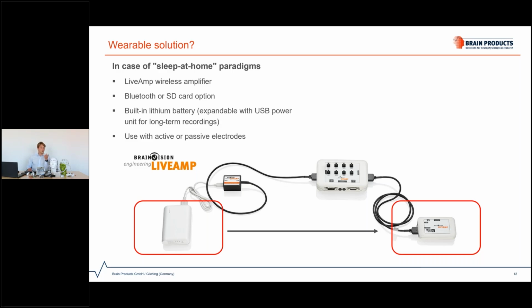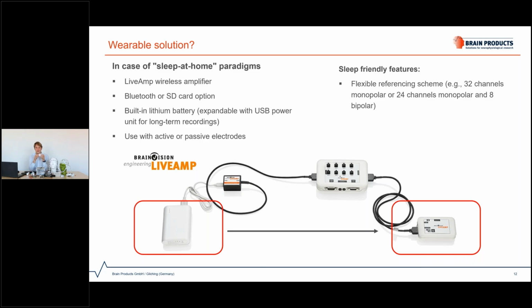Yes, another feature is that the LiveAmp can be used with both active and passive electrodes. So the considerations that we have discussed in the previous slides still hold for the LiveAmp itself. Some sleep-friendly features are the fact that the LiveAmp can use a flexible referencing scheme.